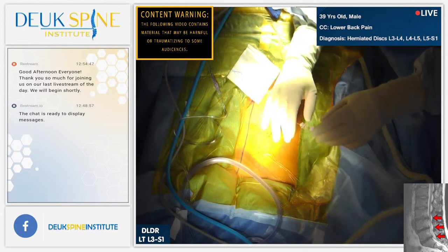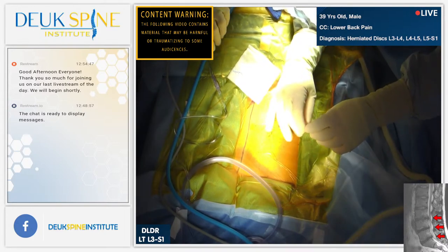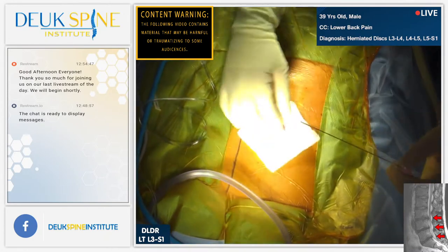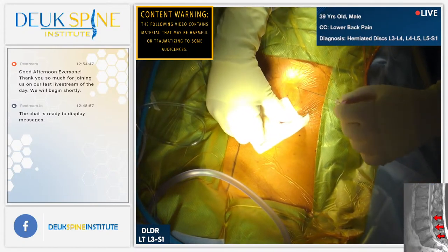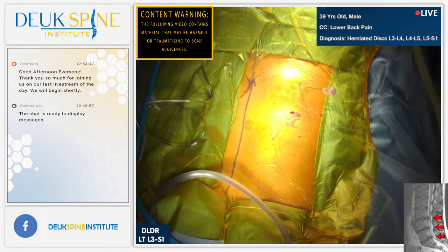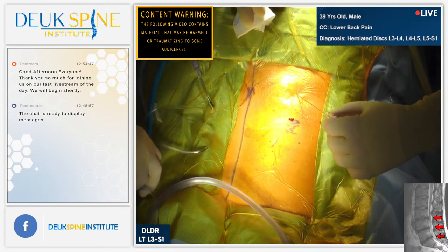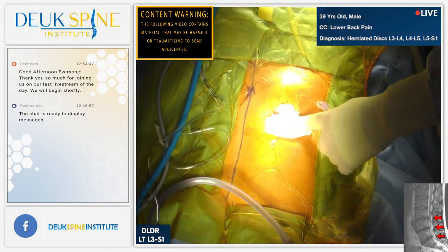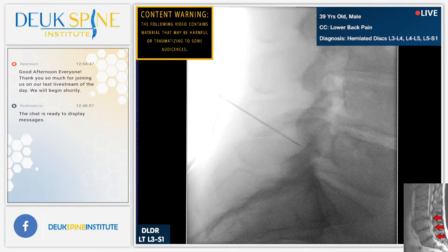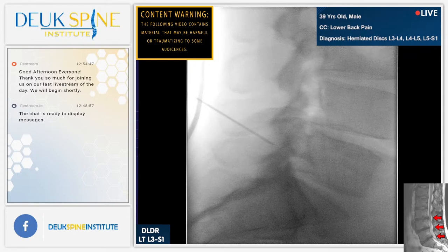Right now I'm just giving some numbing medicine to the tissues to make the patient more comfortable. And then we're gonna get started here. Shot. All right, so I need to aim down a little bit more. You gotta drop the table a little bit. These are small movements, not big movements.